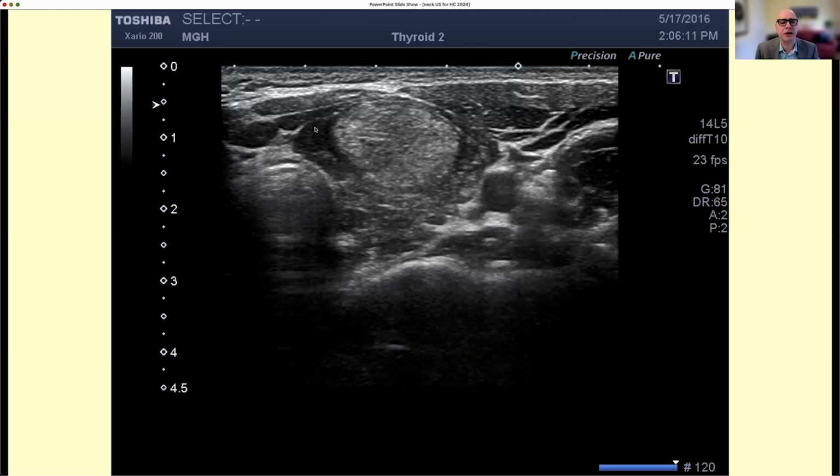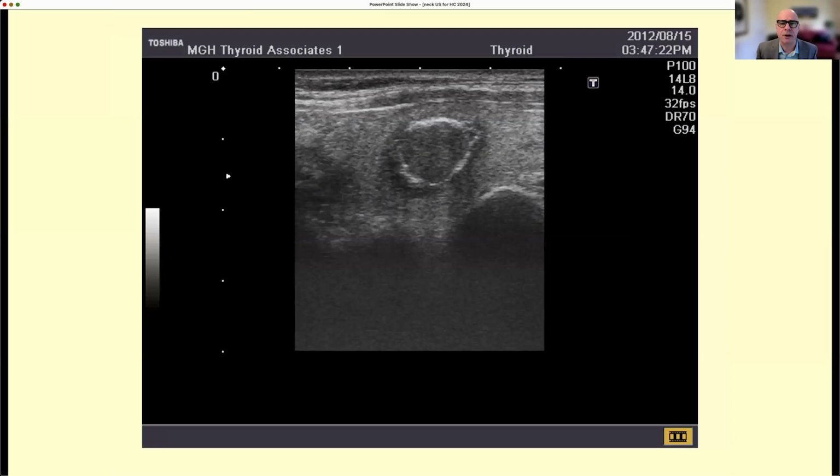And you say that because the rest of the thyroid is hypoechoic, again as hypoechoic as the muscle, and the nodule is solid. In theory, it would be isoechoic in a normal thyroid, but it is relatively hyperechoic to the rest of the thyroid. This is a pattern that we see in Hashimoto's thyroiditis, and those nodules are always benign, so much so that it's one of those benign patterns that I've described to you before.